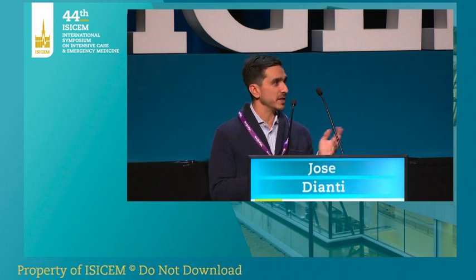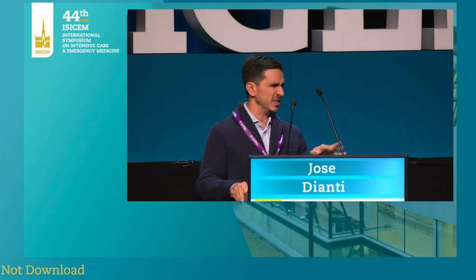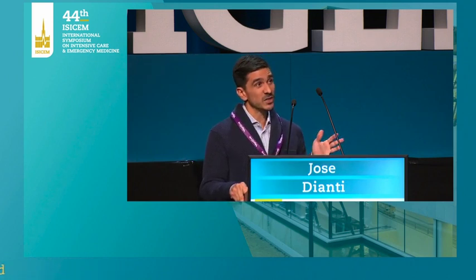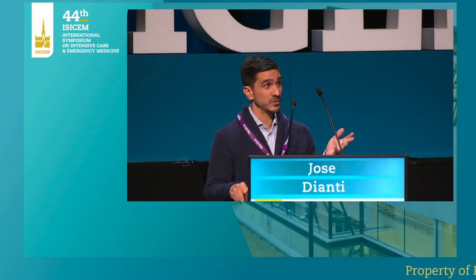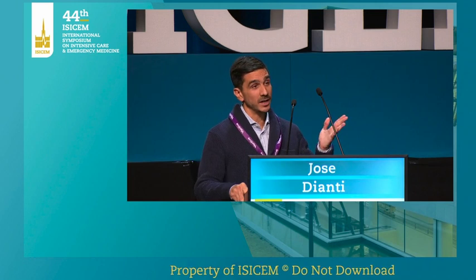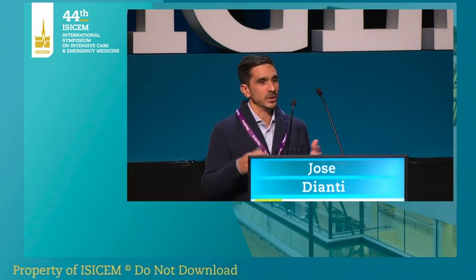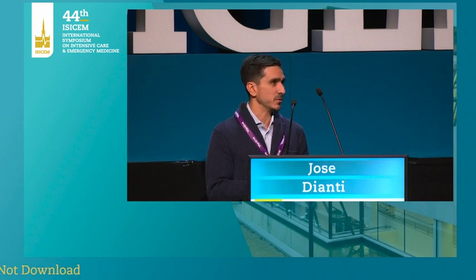And for PMI, I think that's the trickiest one, if that's a word. The maneuver has been shown in different series to be reliable in up to, let's say, 3/4, 80% of the patients, but there's a fairly large number, 20%, 25% of patients in which you can't do it. This is mostly patients who are not relaxing their respiratory muscles while doing the hold, and that can lead to an unstable plateau. As I mentioned before, it could be going up or, if there's a lot of effort, going down. But in those cases, you should disregard that number in terms of using it to titrate whatever intervention you're using. So I would say that's the main caveat there with those non-invasive ones.